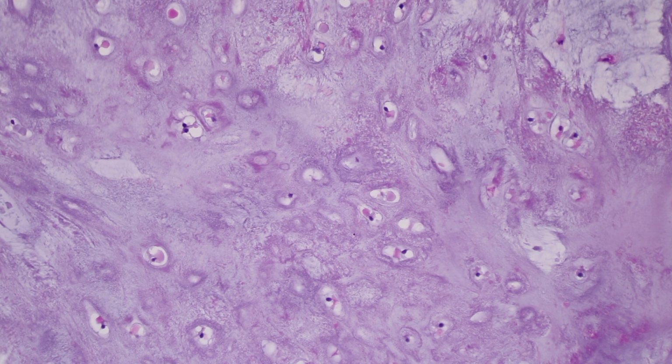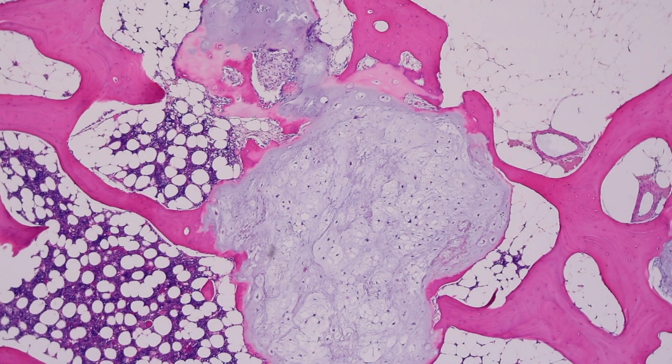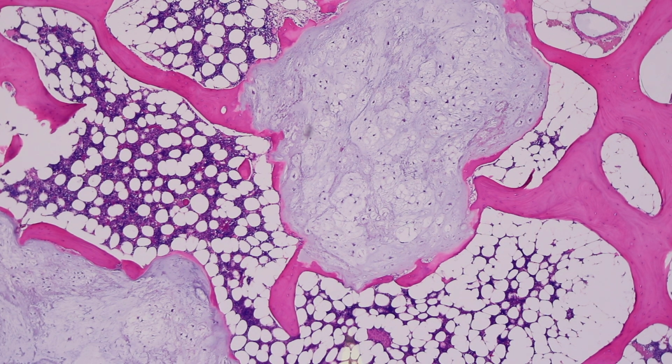So I still believe when our orthopedic surgical colleagues curette this out, let's go to low power, and we see how the bone is rimming the periphery of the nodules, you will get a fragment of cartilage like this, and you'll see, hey, half of it is demarcated by a rim of bone. To me, that means there's a sharp margin. If I see bone trabeculum in the middle of that cartilage, that's when I get concerned or ask the question, is this infiltration or not?